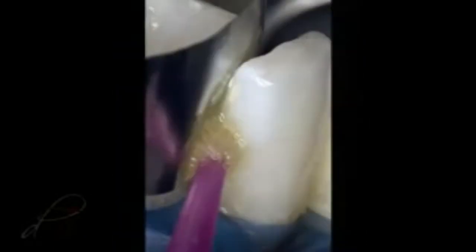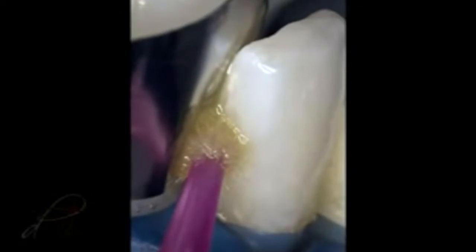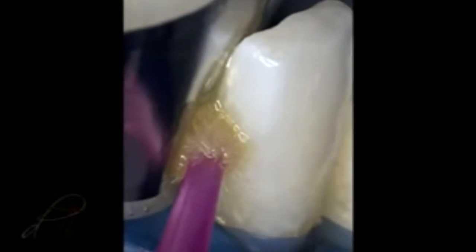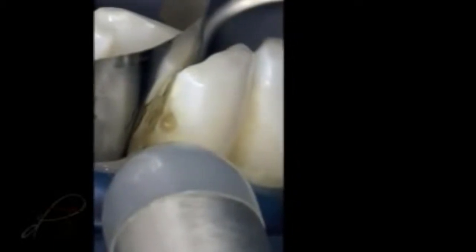A self-etch adhesive, G-ænial Bond by GC America, was placed on the enamel and dentin surfaces with an applicator tip for 10 seconds, air dried for 5 seconds using an A-dec warm air tooth dryer, and light cured for 10 seconds.